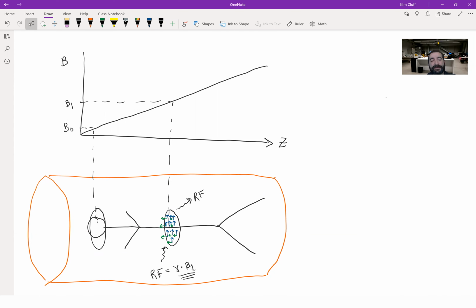One of the big benefits here is it doesn't use any ionizing radiation like in X-ray and nuclear medicine. In nuclear medicine, in a PET scan, you're using a positron that emits 511 kilo electron volts. Remember, it emits back-to-back photons, so that's 1,000 kilo electron volts.